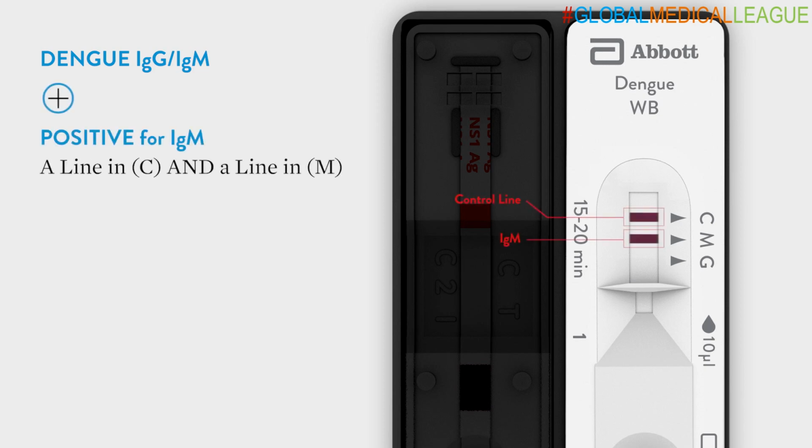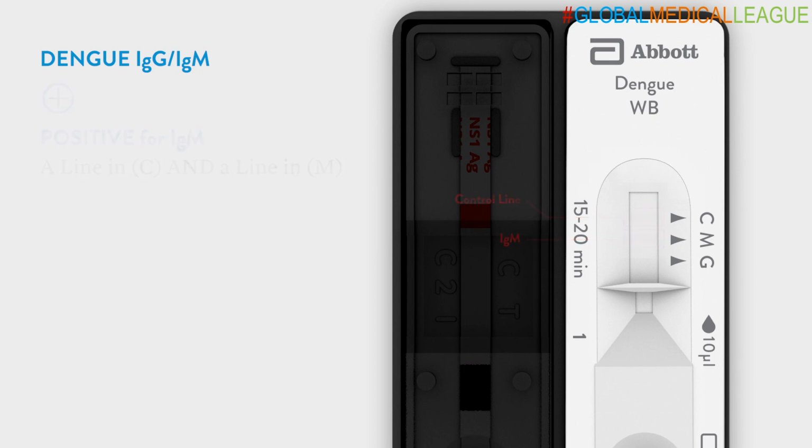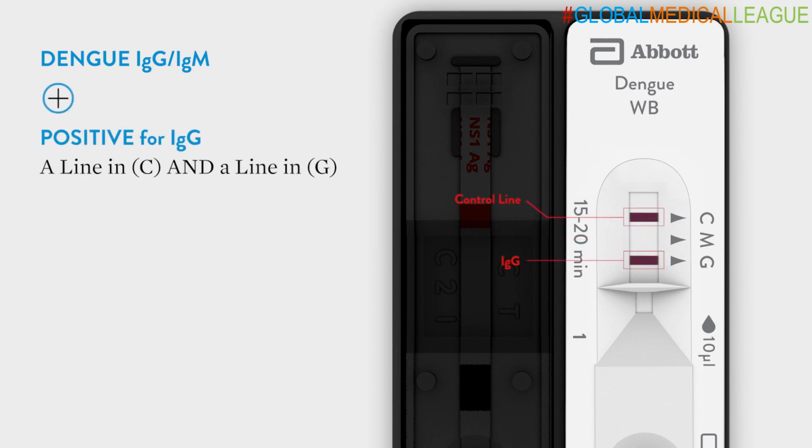A line in C and a line in M means a positive result for Dengue IgM antibody. A line in C and a line in G means a positive result for Dengue IgG antibody. 3 lines in C, M, and G means a positive result for Dengue IgM and IgG antibodies.